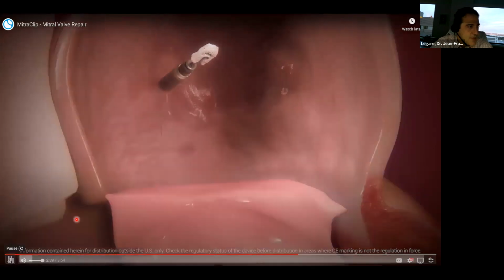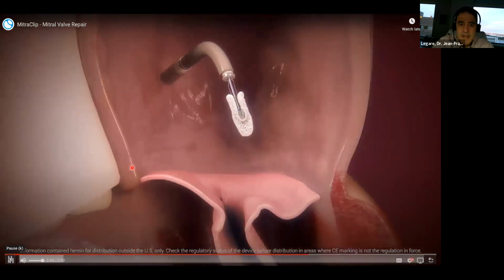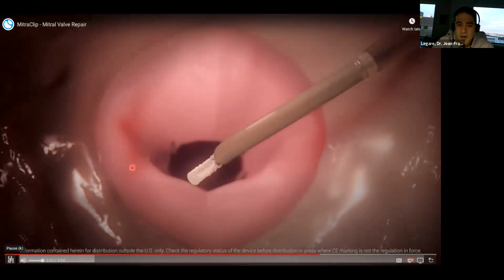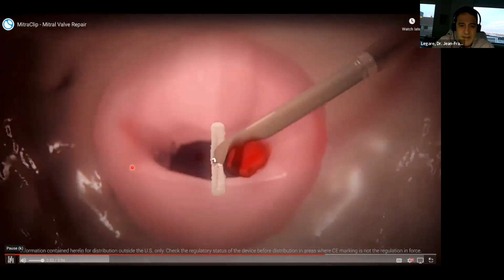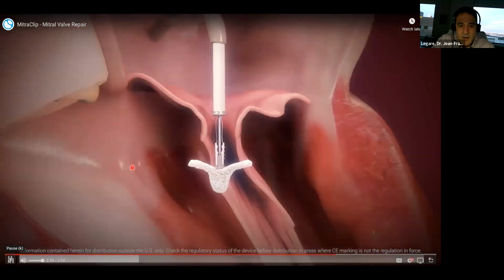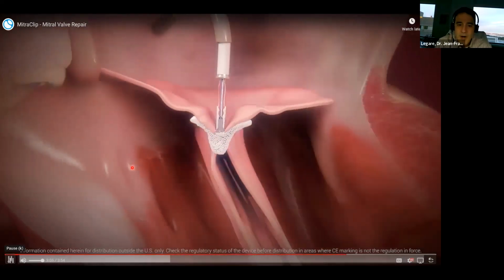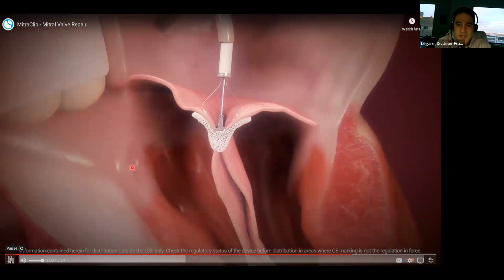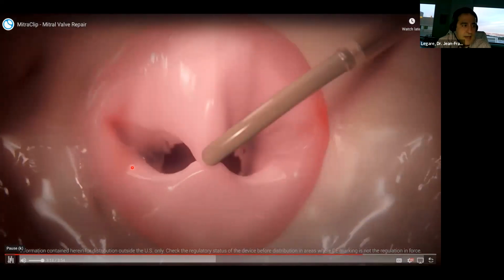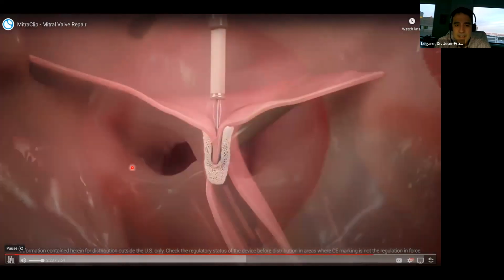And so basically the clip comes through the septum from the right atrium, and then all of the time we spend is orienting that clip exactly in the plane that we want. And we use echo, and this is a tremendous effort from my anesthesiology colleagues in really getting the views that we need to really place the clip without getting caught in the chordae underneath, and in perfect angle to really go and grasp at the spot where the maximal amount of mitral insufficiency would be, and then clip, and then assess it by echo to see how that looks. And this is what you achieve. And if you're not happy, you release it and start again. And this is essentially how we do it.